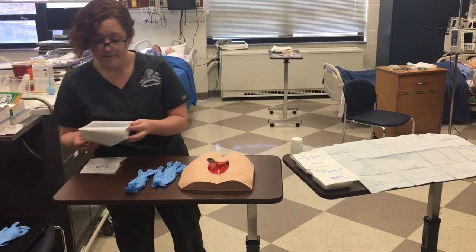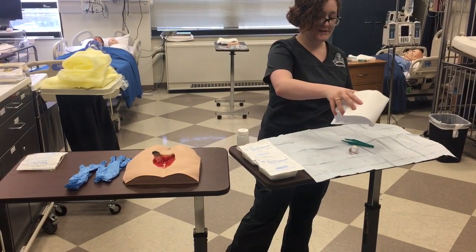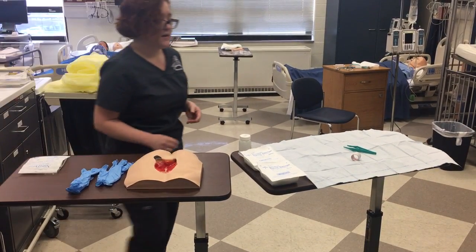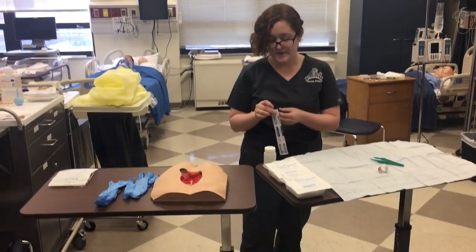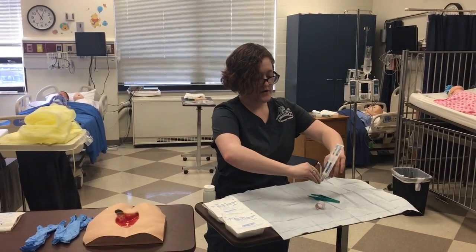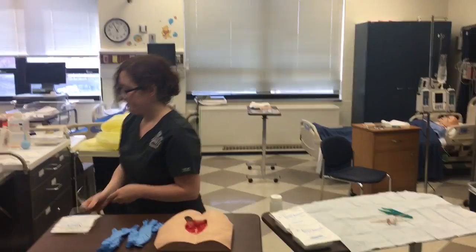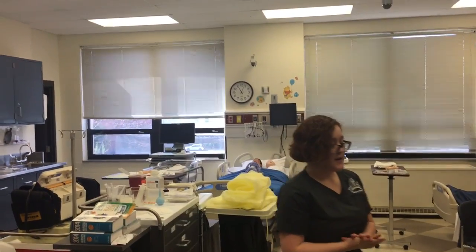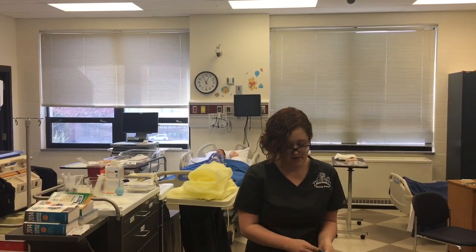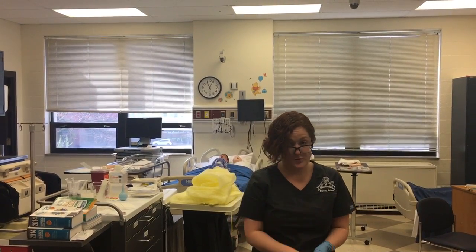Then I'm going to take the rest of the sterile supplies, and I'm going to dump them over 6 inches above, and then I'm going to dispose of this. I am also going to get my cotton tipped applicators at this time that are also sterile, and I'm going to open them over the sterile field and just let them drop in. Okay. Next, I am going to put some gloves on. And I'm going to clean the wound.